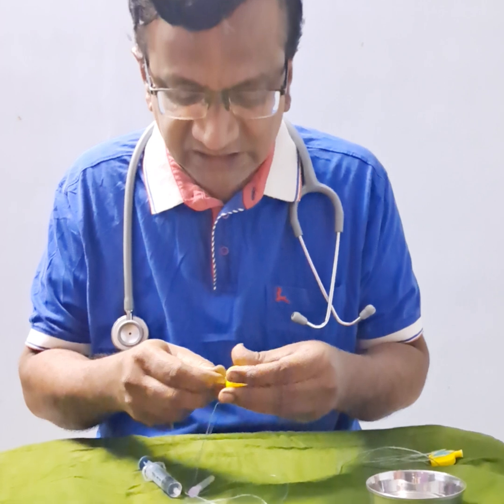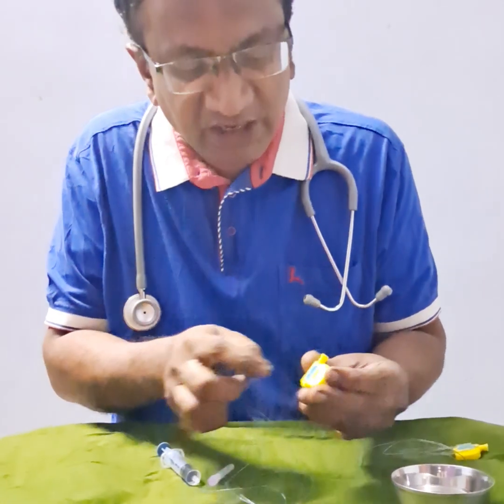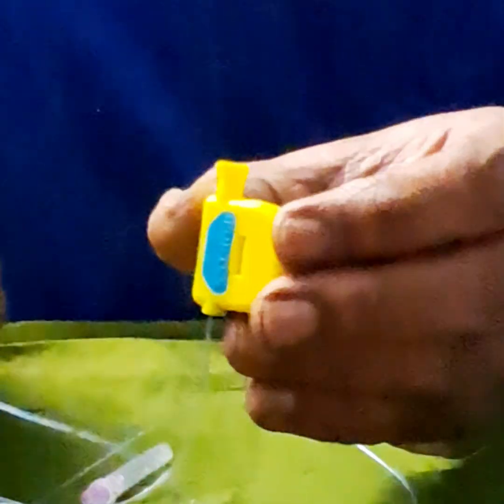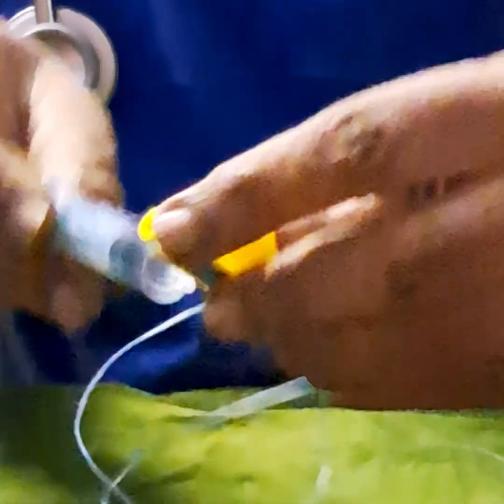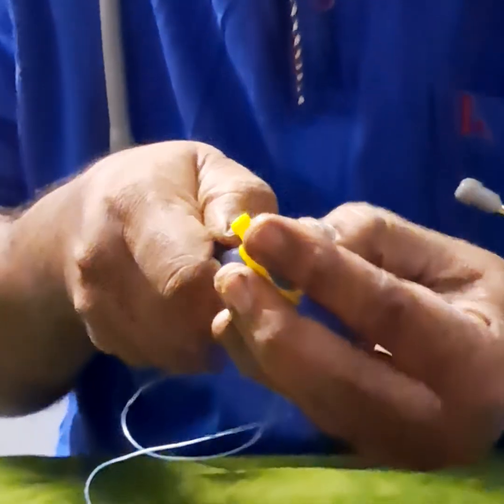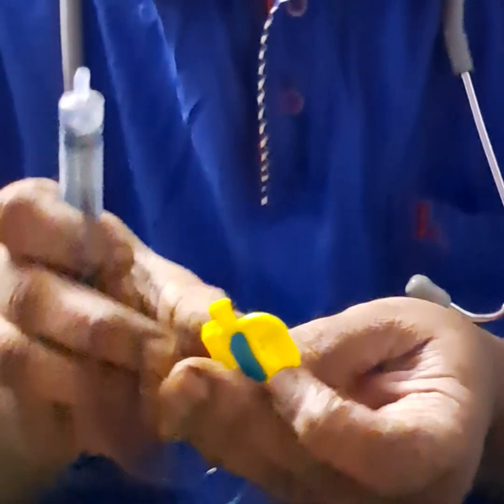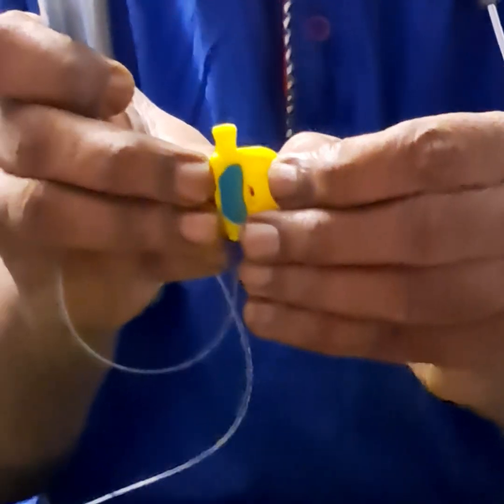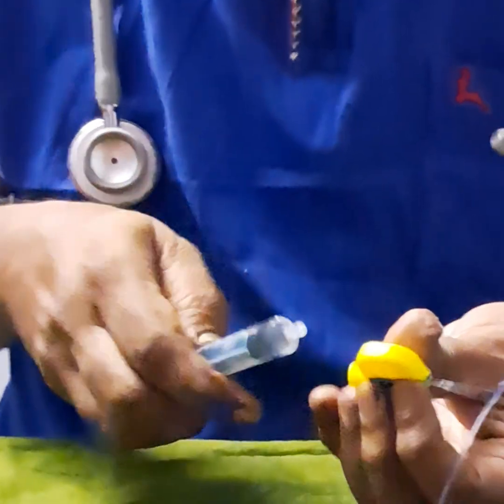Unless you insert the catheter completely and then close it. Now this closure — you can see here — I am focused here. Now I am looking at the other side. What happens when you open it? Now this black hole is visible. Now I am closing it — there is a complete closure, so that this portion is compressed.